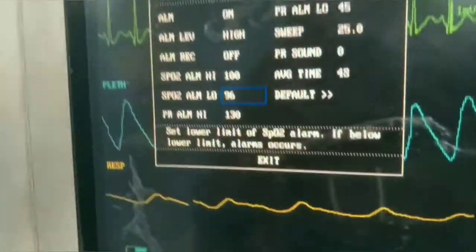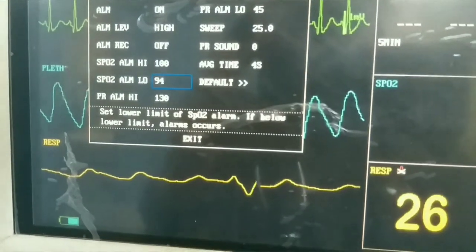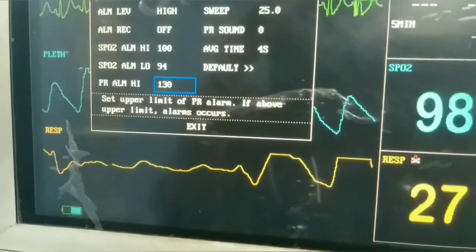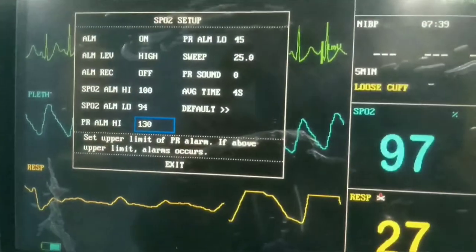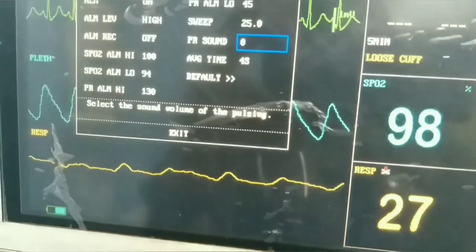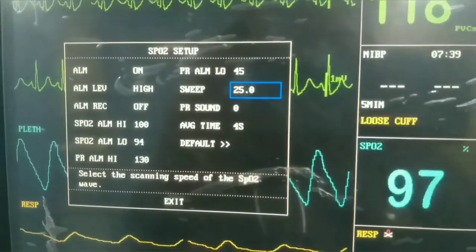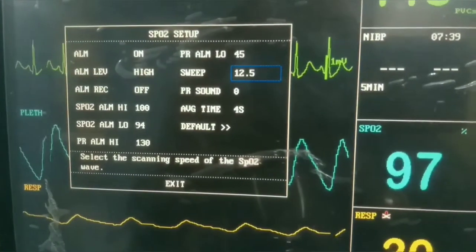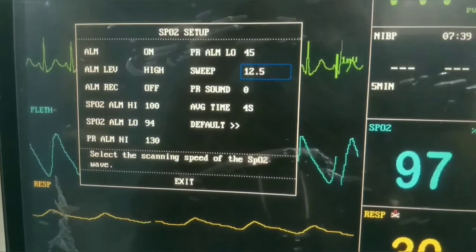For example, in a COPD patient, if saturation goes higher than 94% and alarms are set accordingly, it will start beeping. Similarly, in a hypoxemic patient where you do not want saturation to drop below 88%, an alarm will beep once it goes below that. There are other settings more technical in nature, so it is better to focus on the clinically important ones.